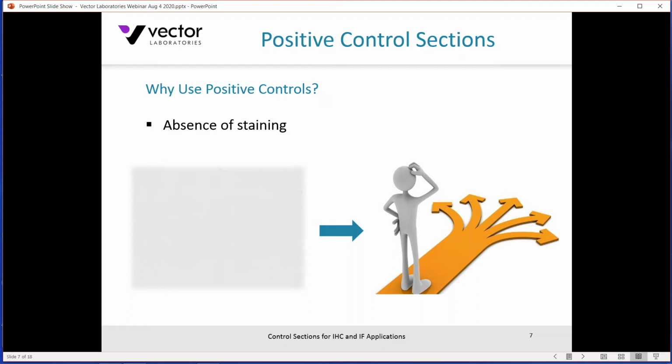And you'd certainly then use the positive control. Did that work? Did that give appropriate staining? Therefore, you can identify which parts went amiss and may need to be refactored in your test specimen.